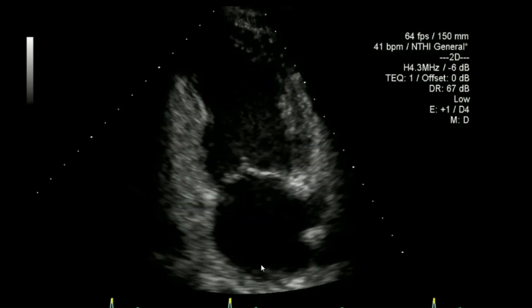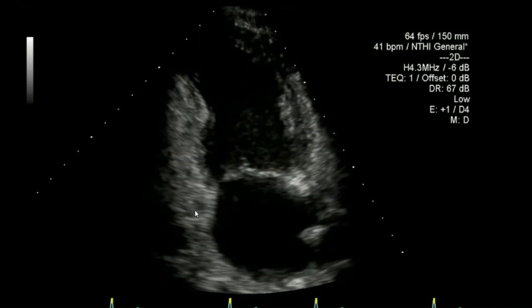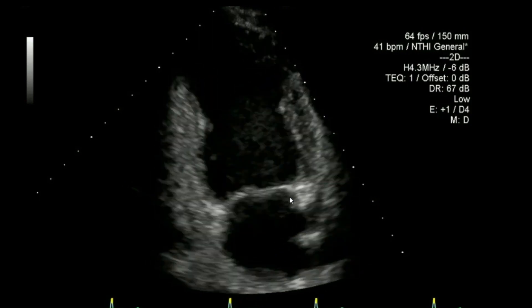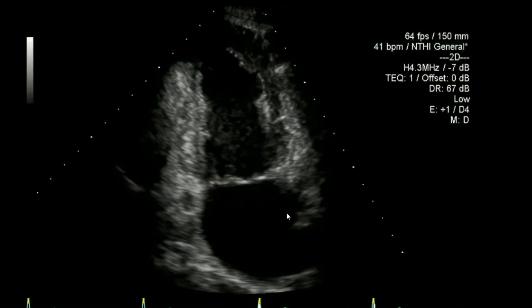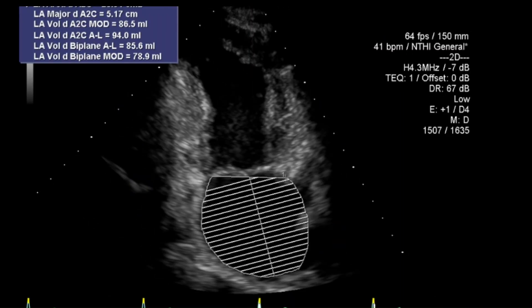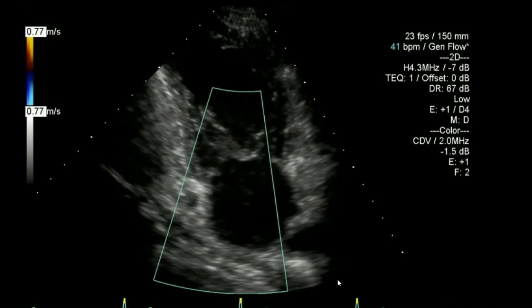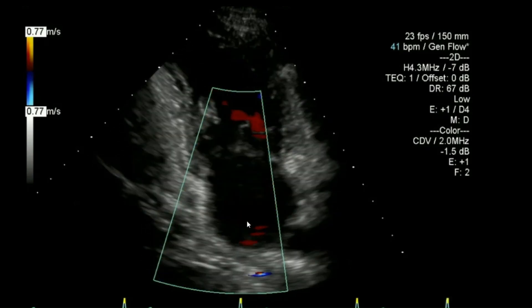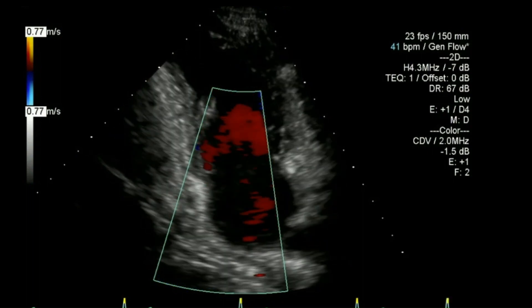Here I'll open up the left atrium as much as possible — you can see the left atrial appendage to the side and the valve en face relatively. I'll measure the left atrial volume to get a biplane volume as a routine. Similarly I'll open up and try to maximise showing how much mitral regurgitation there actually is — it's more in keeping with mild.